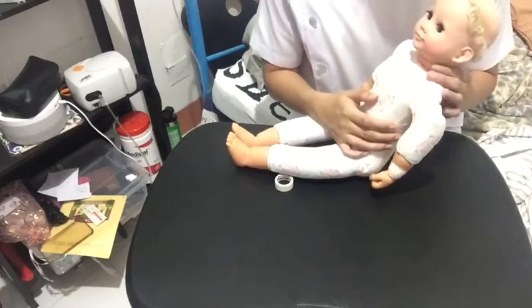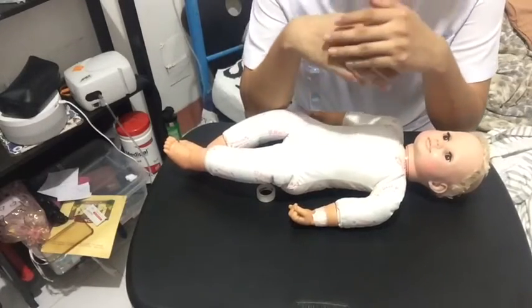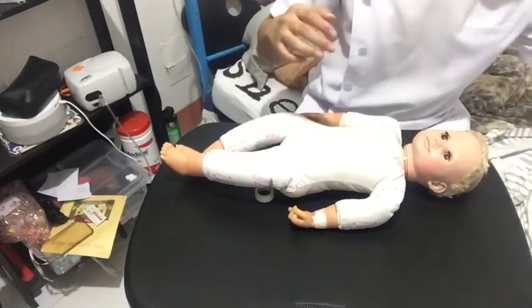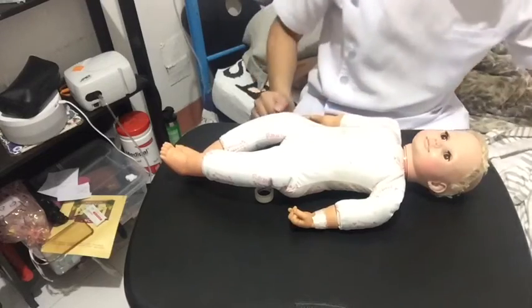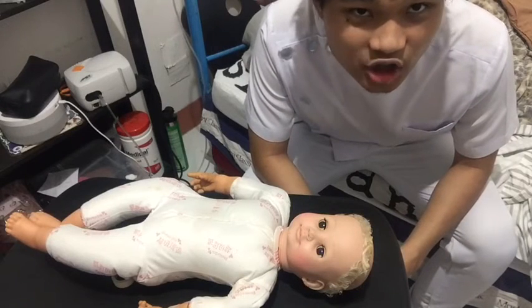From there, we let the client rest. After that, we're going to be performing proper hand hygiene after the procedure. And next, we're going to document what we have done, what we have administered on the client. And that's pretty much our nebulization checklist.